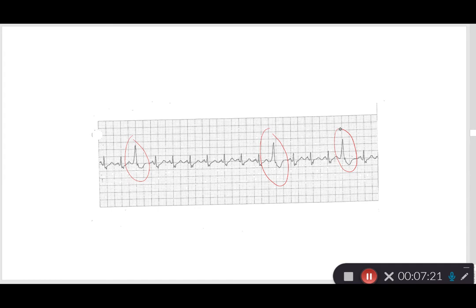My underlying rhythm, I have a P wave, a narrow QRS, a normal T wave. My J point is maybe a little low, so maybe some ST segment depression there. So this is a sinus rhythm. Let's find out if it's tachycardic or not. So I have 5, 10, 12. So it is going to be tachycardic. If I do 1500 divided by 12, I get 125 beats per minute. So my underlying rhythm is sinus tach at 125.